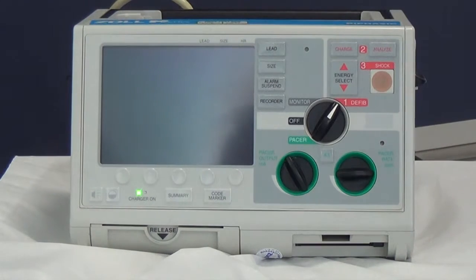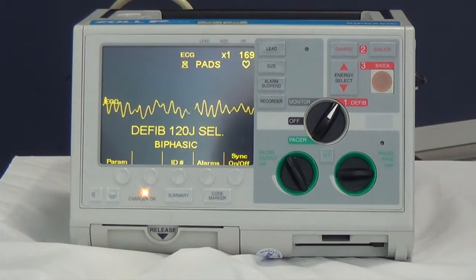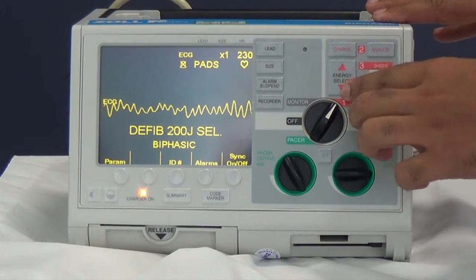Analyze the rhythm. In this case this is ventricular fibrillation, and warn the team that you're getting ready to shock. The first stage is to choose the energy — in this case we're going to select 200 joules.